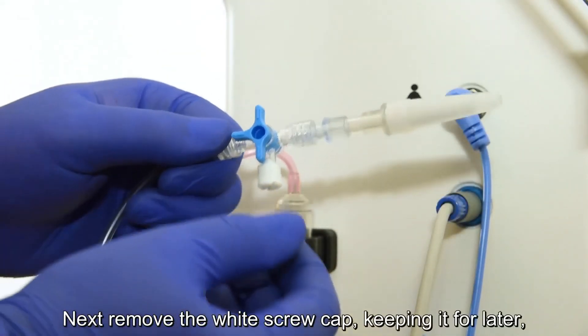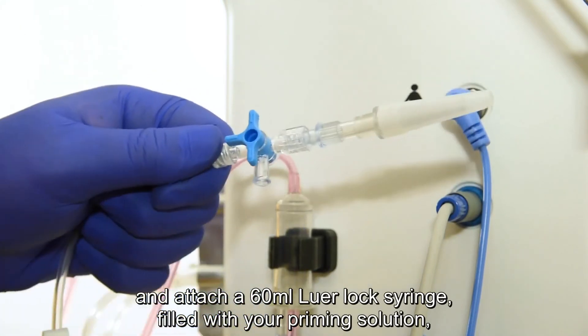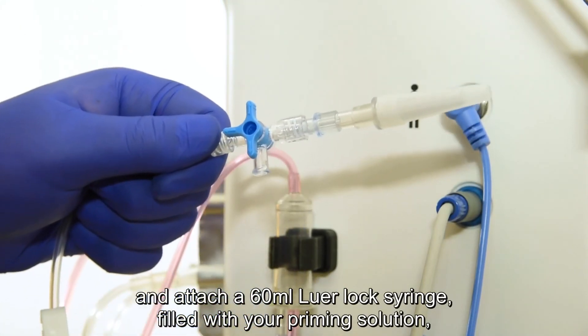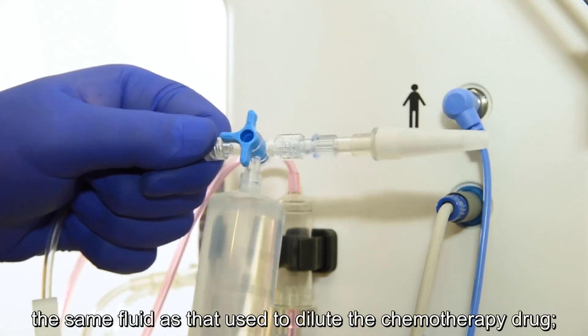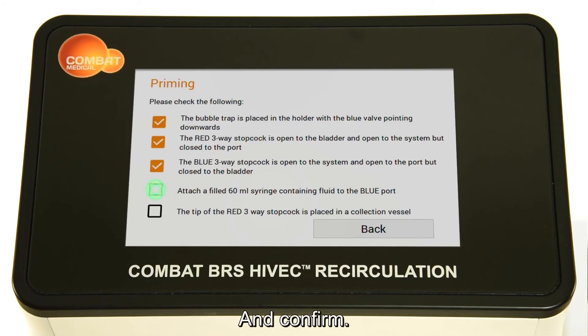Next, remove the white screw cap, keeping it for later, and attach a 60ml Luer Lock syringe filled with your priming solution. The same fluid that is used to dilute the chemotherapy drug. Saline or sterile water are most commonly used. And confirm.